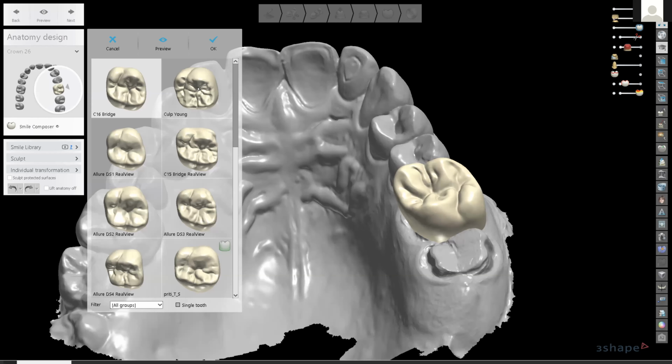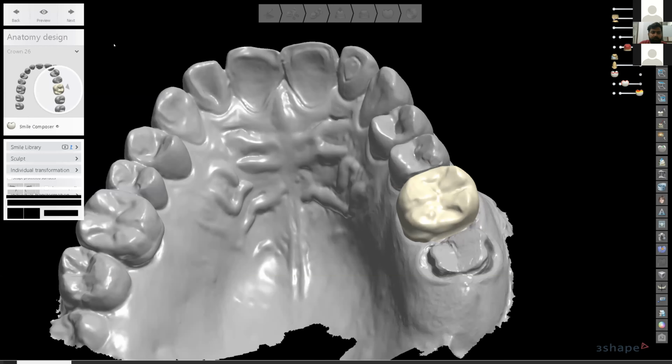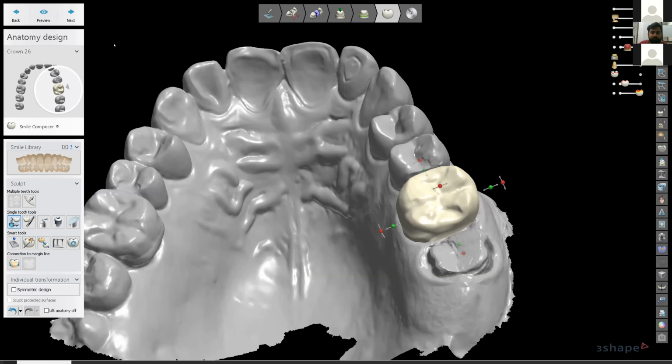And we get the same thing for the designing. Plus the contralateral designing is always there. We can customize our own designing as well. So for the dental part, ma'am, the most important thing is making the margin line and accuracy.